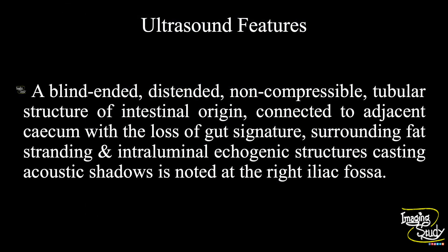In summary, a blind-ended, distended, non-compressible tubular structure of intestinal origin connected to the adjacent cecum, with loss of gut signature, surrounding fat stranding, and intraluminal echogenic structures casting acoustic shadows is noted at the right iliac fossa, indicating gangrenous appendicitis.